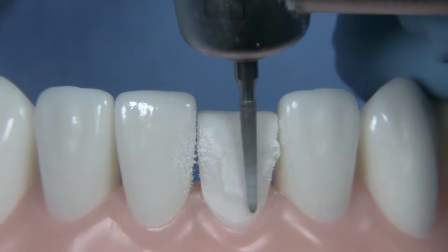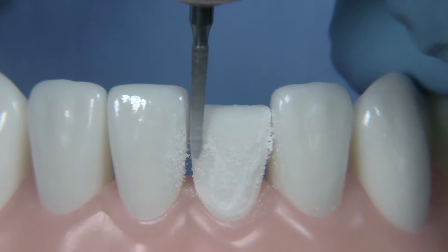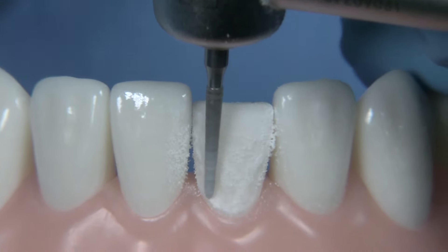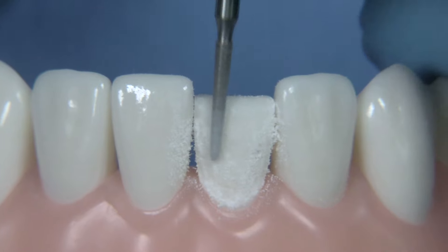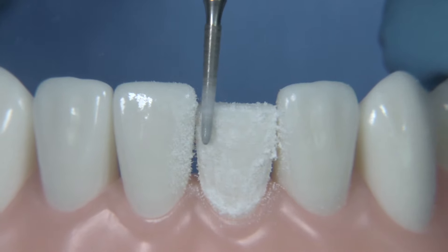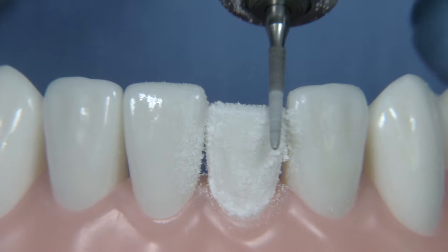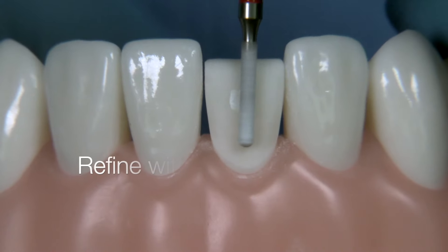I think it's quite helpful to use an electric handpiece and turn the speed down to perhaps as little as 5,000 RPM. If you don't have an electric, I would use your slow speed with a friction grip attachment. I think at this point we're just about ready to move on to the final smoothing. It's really critical to smooth your preparations very well so that your technician can make a very smooth intaglio to your ceramic. The notion that you should leave a rough surface doesn't make a lot of sense because we're going to be acid etching and creating micromechanical retention — so smooth preparations are always appreciated by technicians.